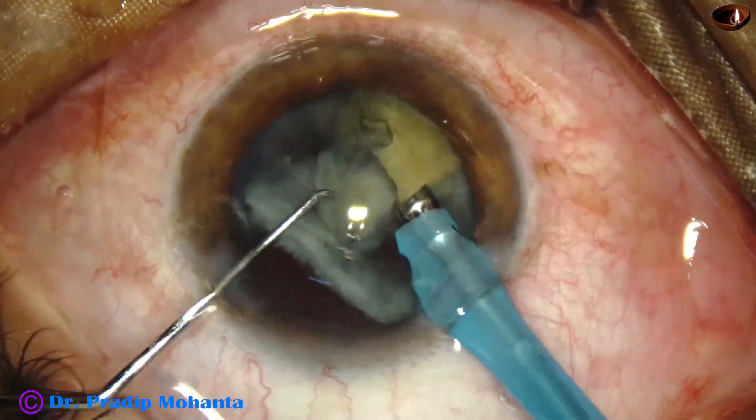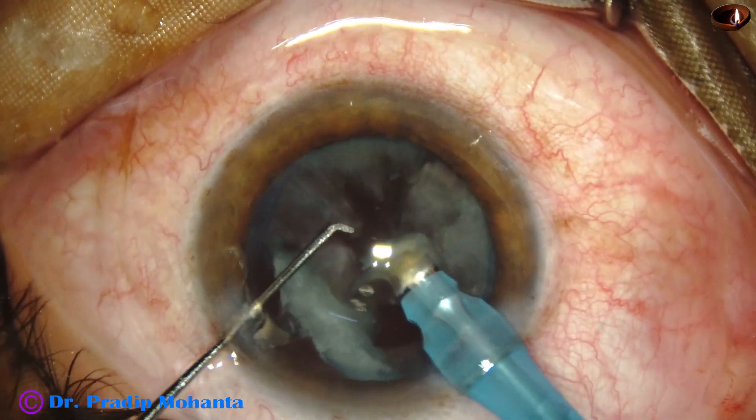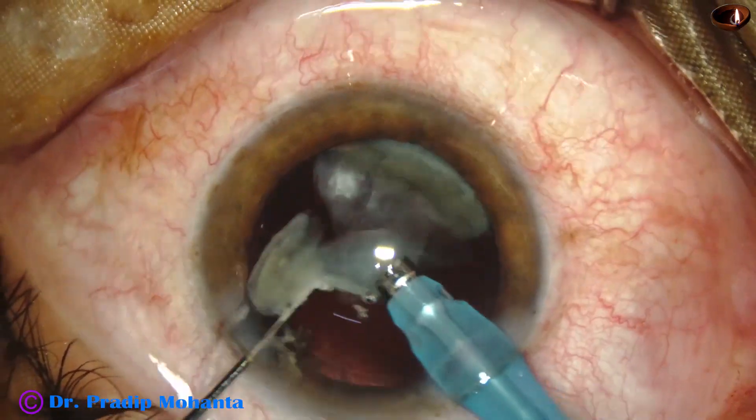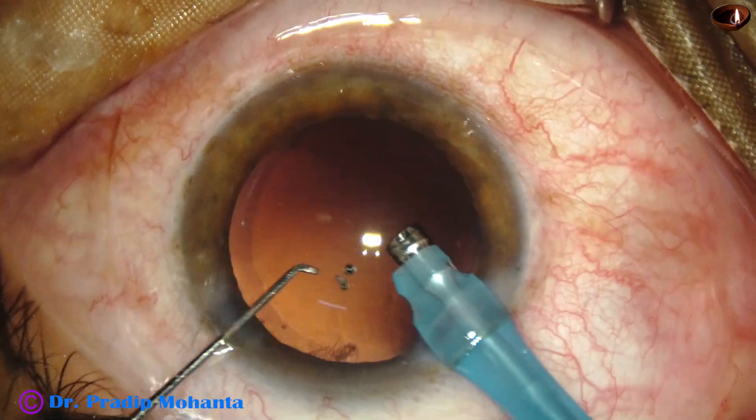As the nucleus is removed, use a little lower vacuum and a little bit of ultrasonic energy to remove this epinucleus shell.